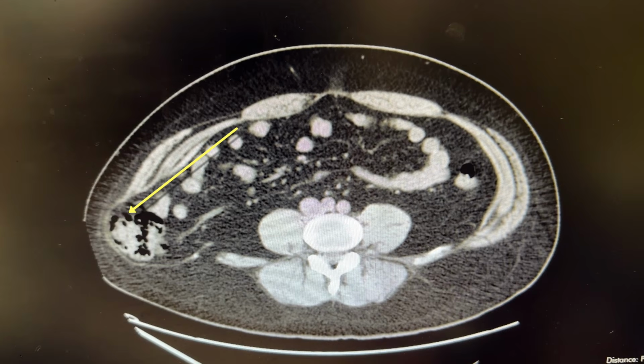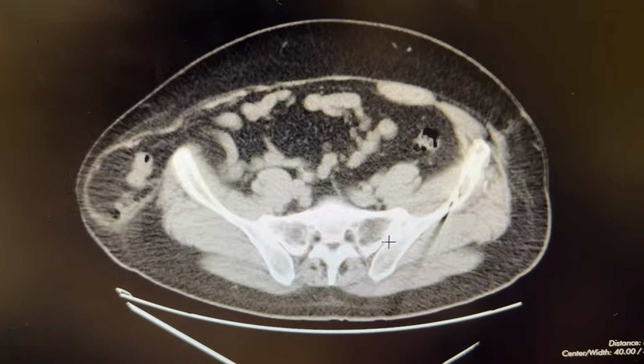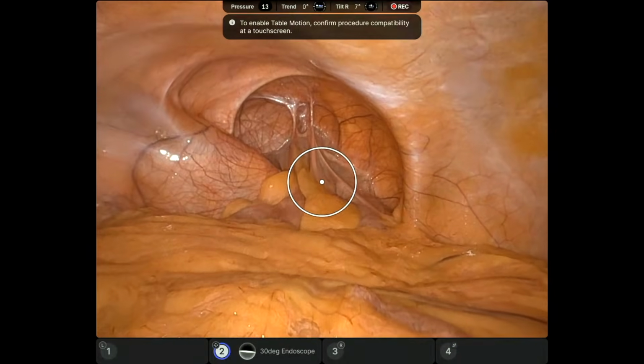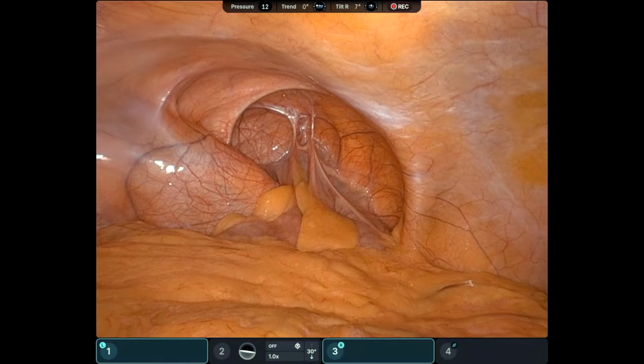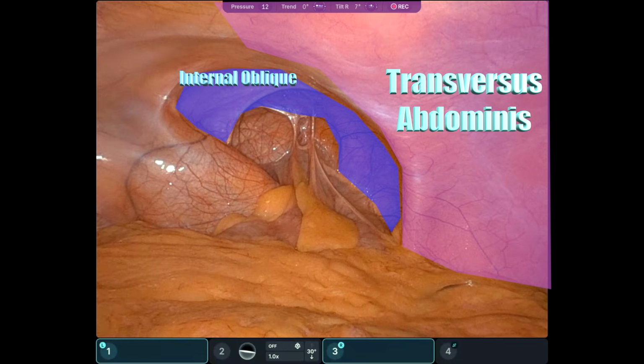CT scan of the abdomen pelvis shows our operative plan: pre-peritoneal dissection from underneath the right rectus, across the abdominal wall, reduction of the hernia sac along with a sliding colon component, while bringing back the 3 layers of the abdominal wall back to the iliac crest. After prehabilitation, patient lost weight to increase his level of fitness, was no longer scared of working out.